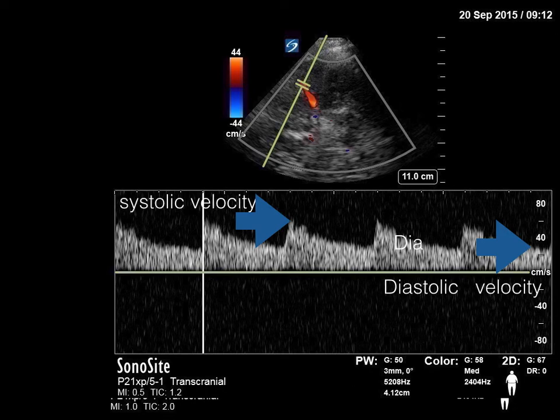This is how it became a class 1 indication for treating and managing sickle cell disease patients, those who die at an early age. So with the use of ultrasound, I mean transcranial Doppler, their lifespan can be increased. At the right time, you can transfuse a unit or two of blood, then the sickle cells in their body will decrease at that period of time. In this way, you can prolong their longevity.